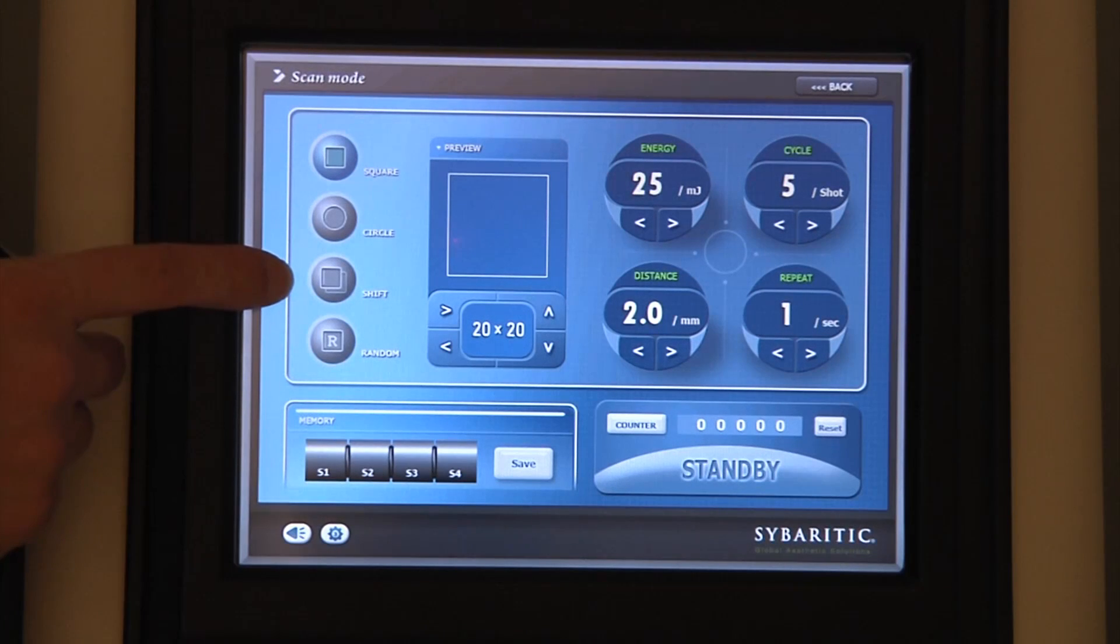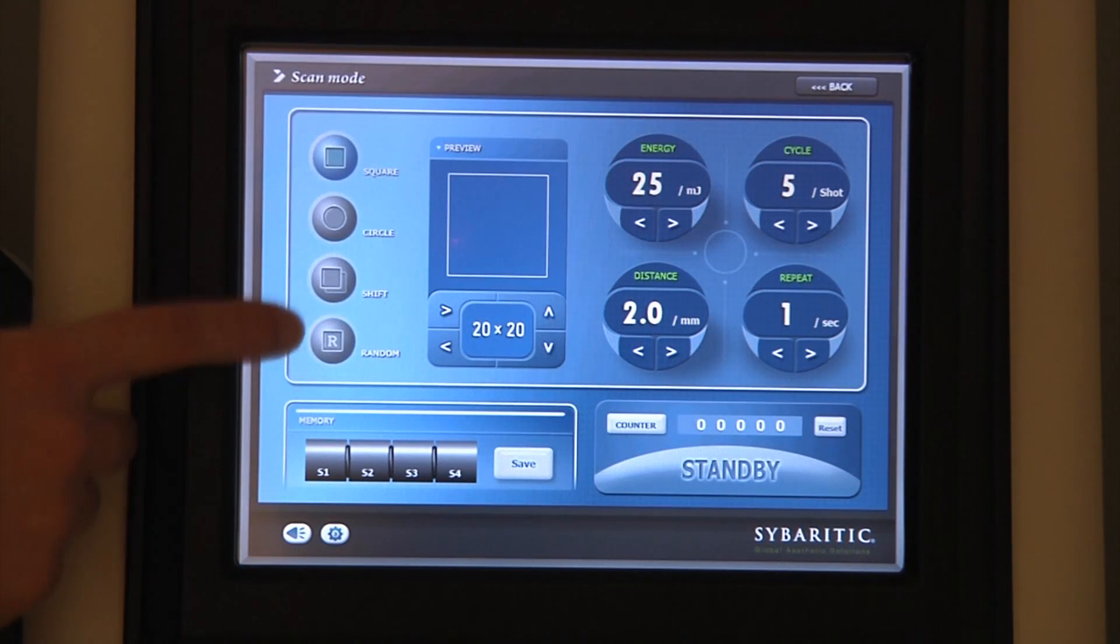In the shift mode of operation, we're able to do a single pass in whatever the scanning area geometry is, and then the device immediately paints a second pass slightly shifted off from the first pass. That's useful when we want to do multiple passes in which we don't want the microthermal zones to align.